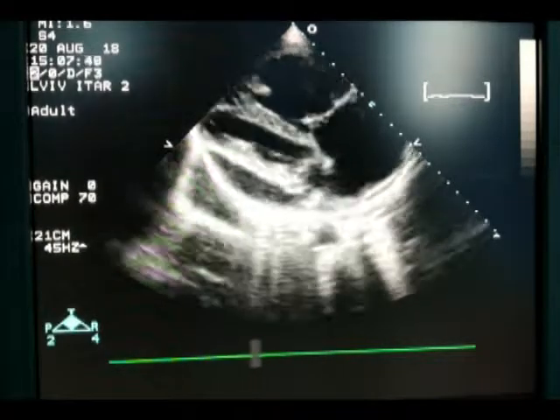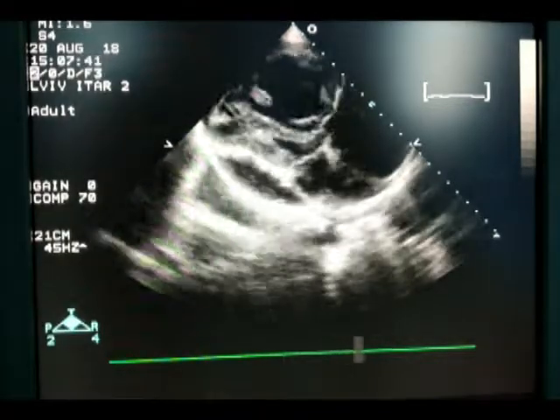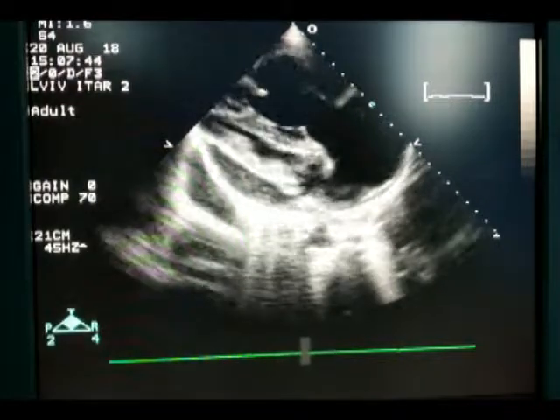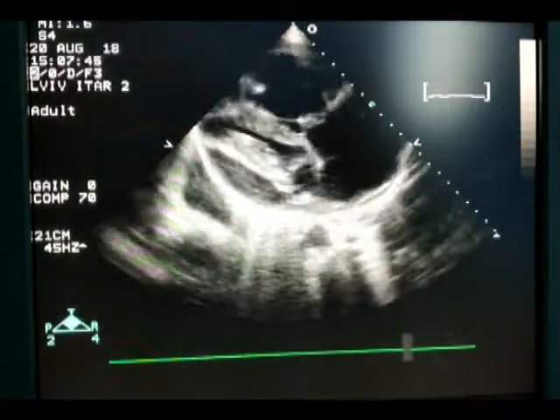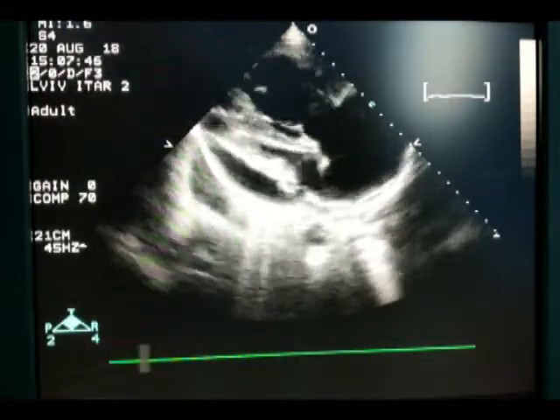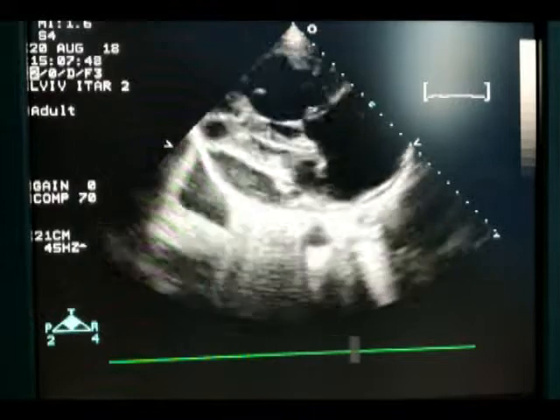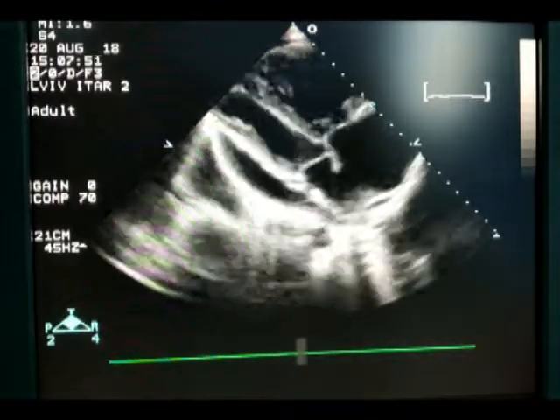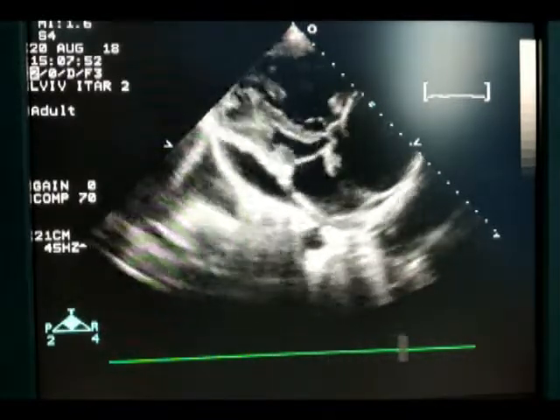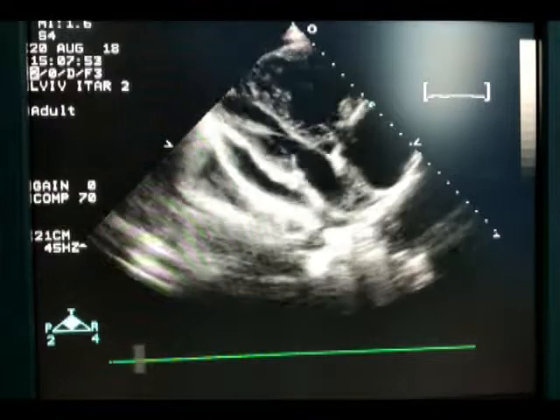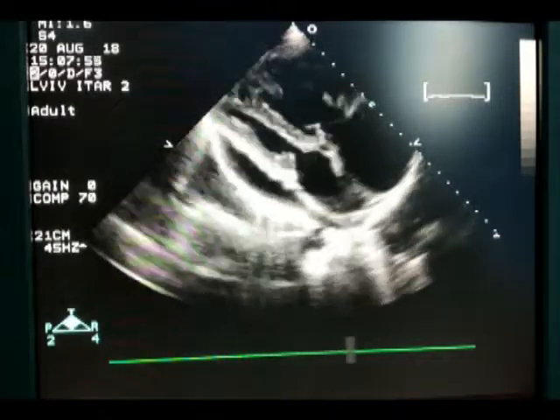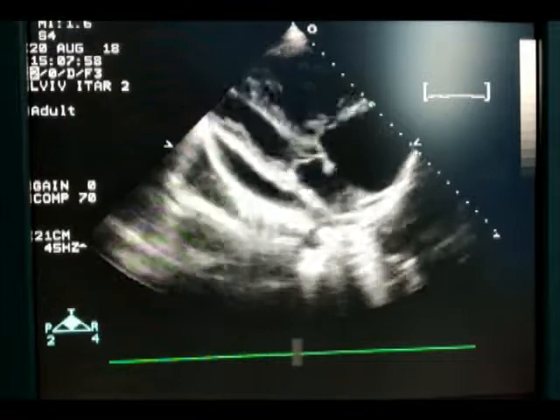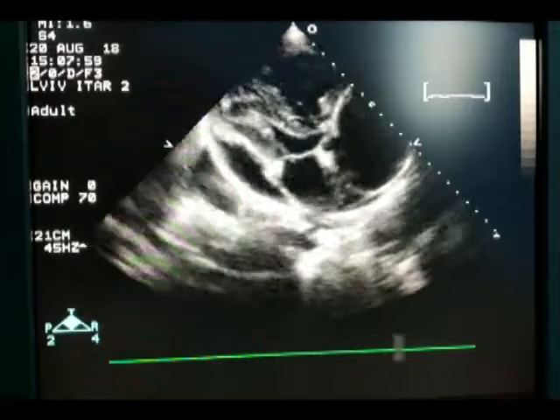I am performing transthoracic echocardiography in a patient who was taken in ICU with the symptoms of congestive heart failure. Earlier she was diagnosed with primary pulmonary hypertension. I was asked to make a dynamic echocardiographic assessment of this patient after she has received intensive treatment: dobutamine, furosemide, bosentan, etc.